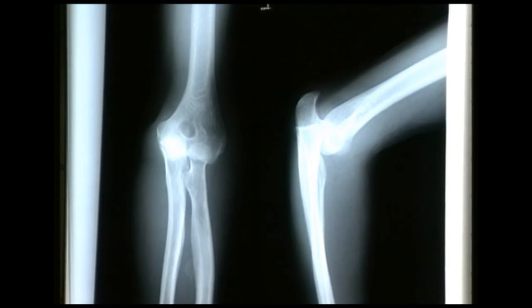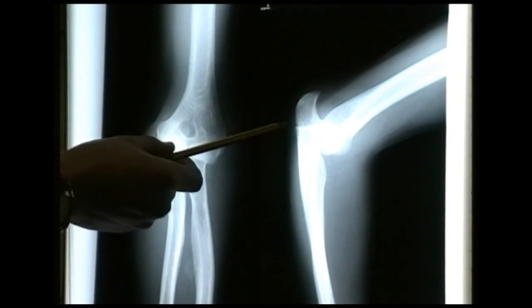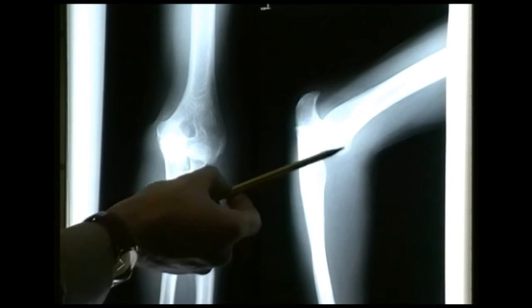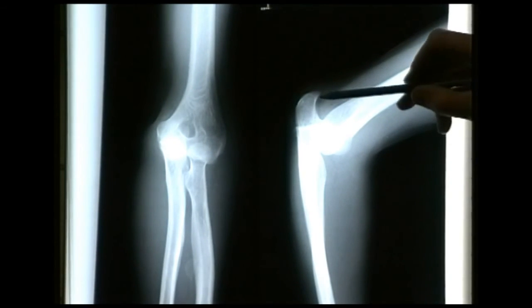These radiographs illustrate the value of taking two planes at 90 degrees. We have the anteroposterior radiograph on the left and on the right a lateral view of the same left elbow. There are no obvious fractures but there's certainly a dislocation of the elbow joint. To the trained eye it would be quite obvious on the AP view, but to the less trained eye it's far easier to spot in the lateral view, where the elbow joint is clearly dislocated. It should be in continuity with the humeral condyles — it's a posterior dislocation.